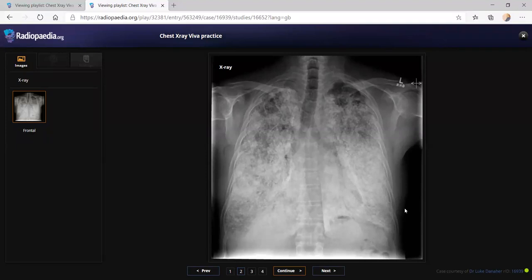Is that a case of pulmonary alveolar microlithiasis? Or is it an ossifying condition of the lungs? I'm not able to remember the name. So, what will you do? So, I'd like to compare with any previous radiographs if available, and also would like to look at the medical history. The previous radiograph one year back was the same.